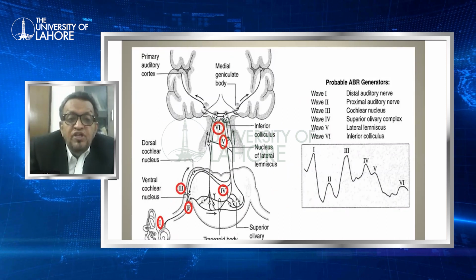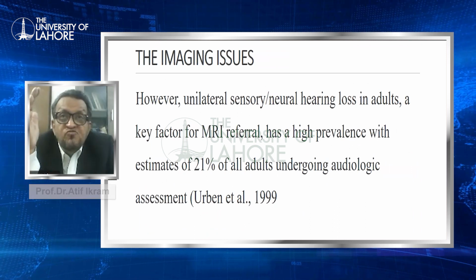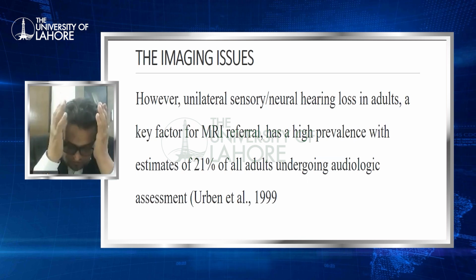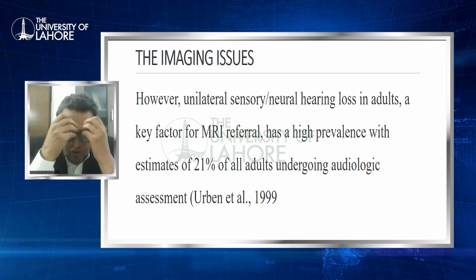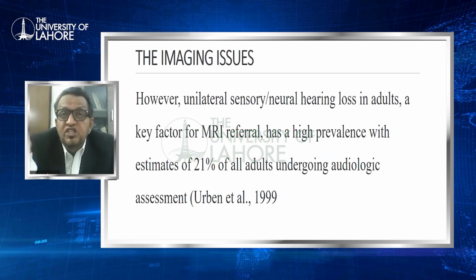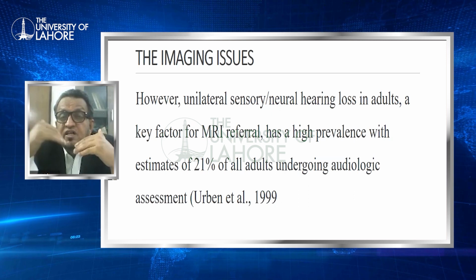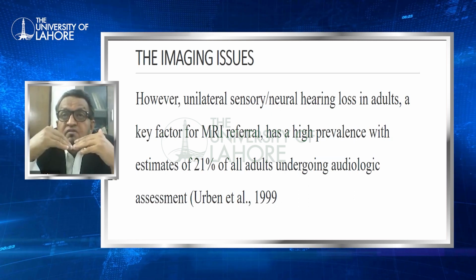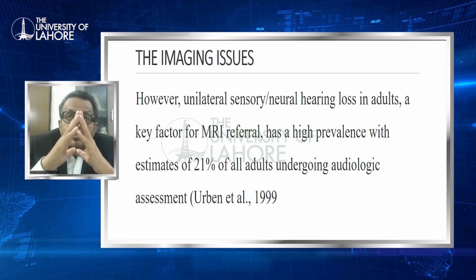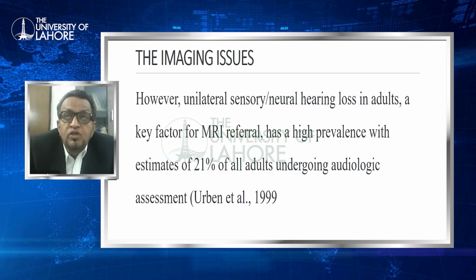The generator sites we've already discussed. However, when a patient comes to you, now we are going towards the clinical aspects of acoustic tumors: what is the history, the audiometric findings, and the findings from other tests that make us go towards a differential diagnosis of acoustic tumor or acoustic Schwannoma.